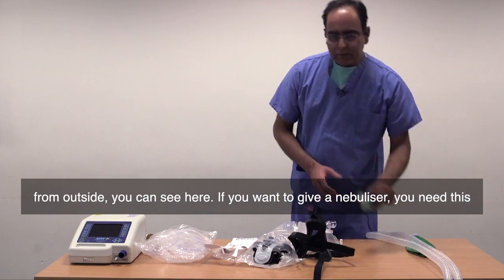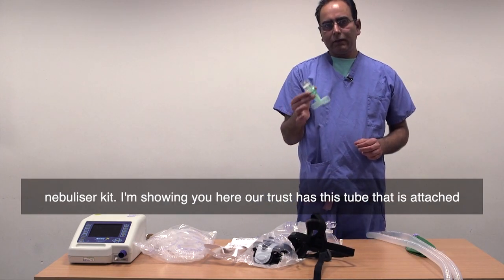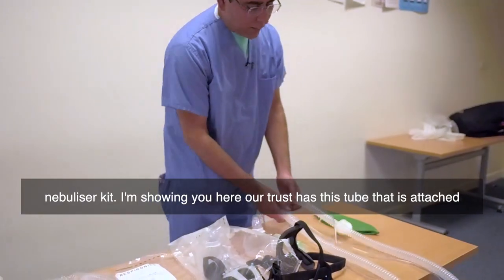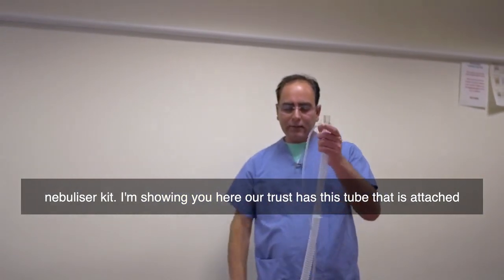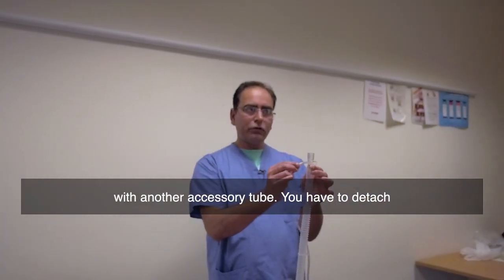If you want to give a nebulizer, you need this nebulizer kit. Our trust has this tube that is attached with another accessory tube.